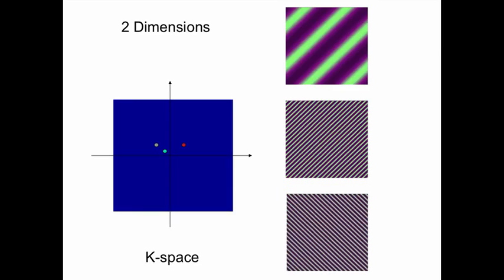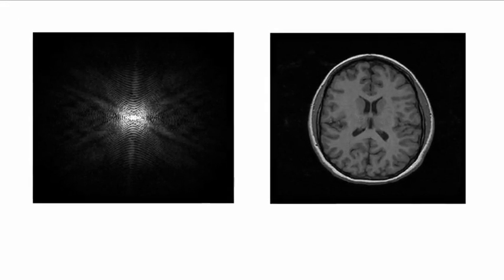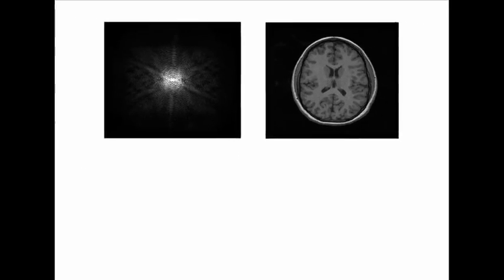So basically what we have in K-space is that each point represents how much we should weigh a sinusoidal wave form like this. And it's the linear combination of all these sinusoidal wave forms weighted by their K-space measurement that gives us the image. Now that's kind of hard to believe when you see this K-space. So basically these K-space measurements are weighing these sinusoidal wave forms, and what I'm claiming here is that the weights of these K-space measurements will give us this beautiful image. And that can be a little difficult to believe at first view.